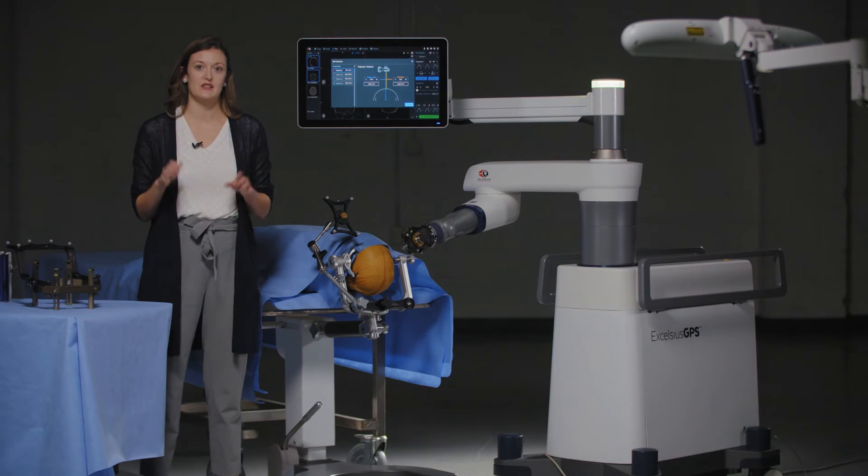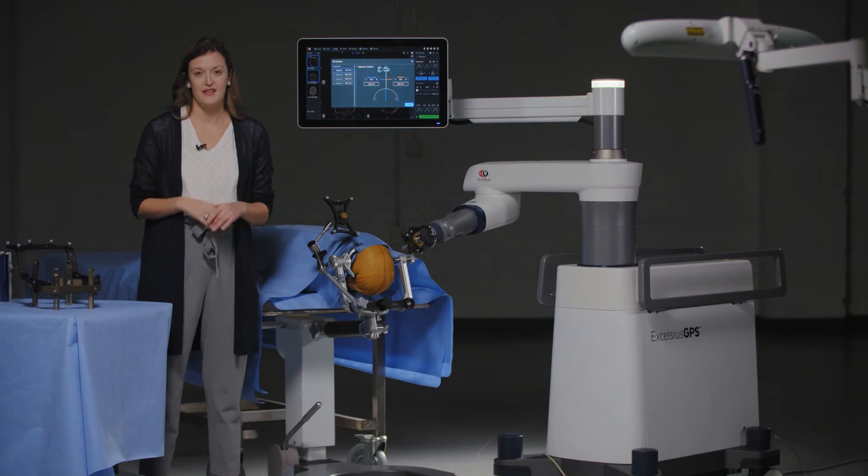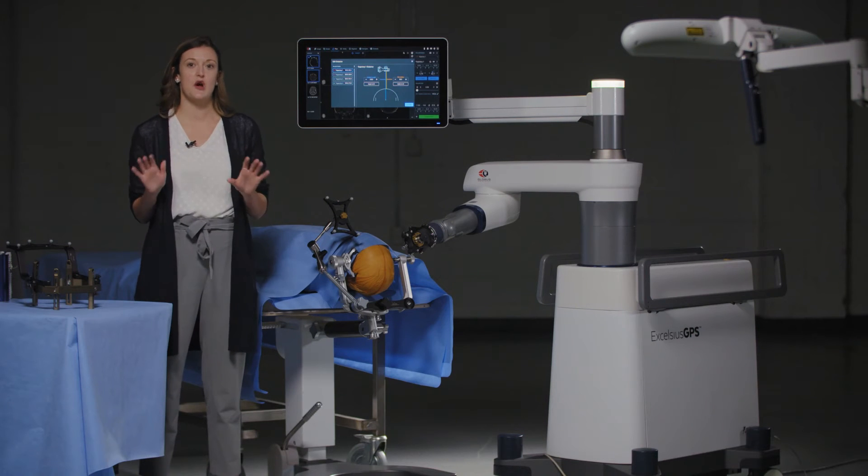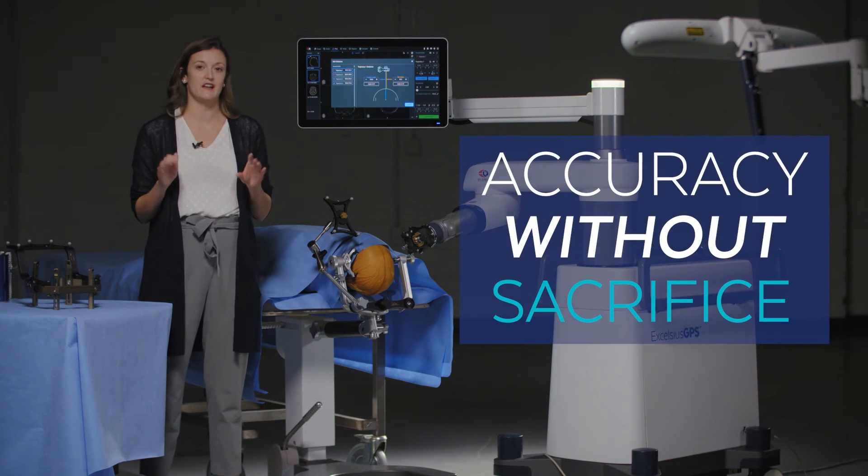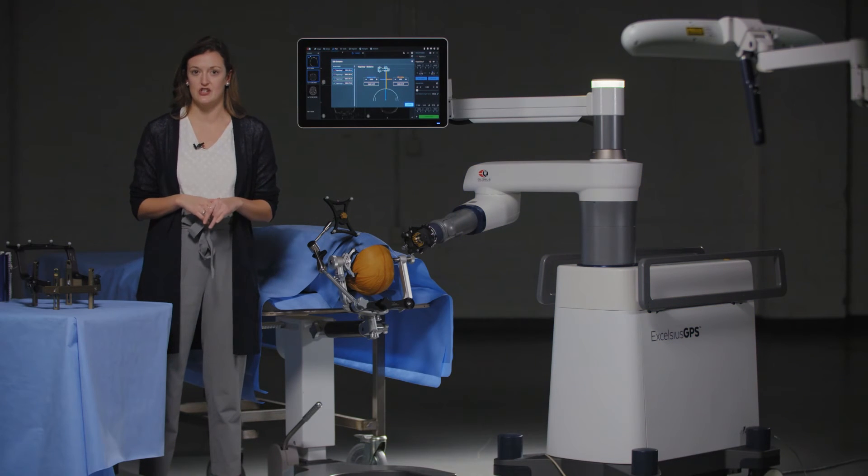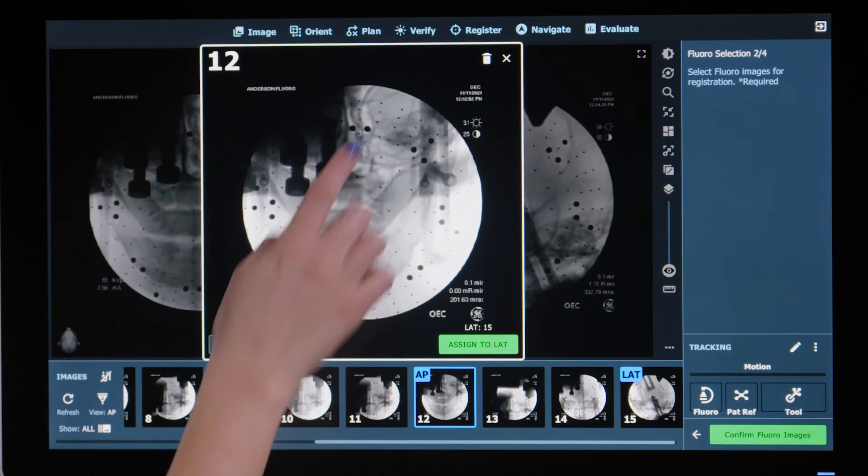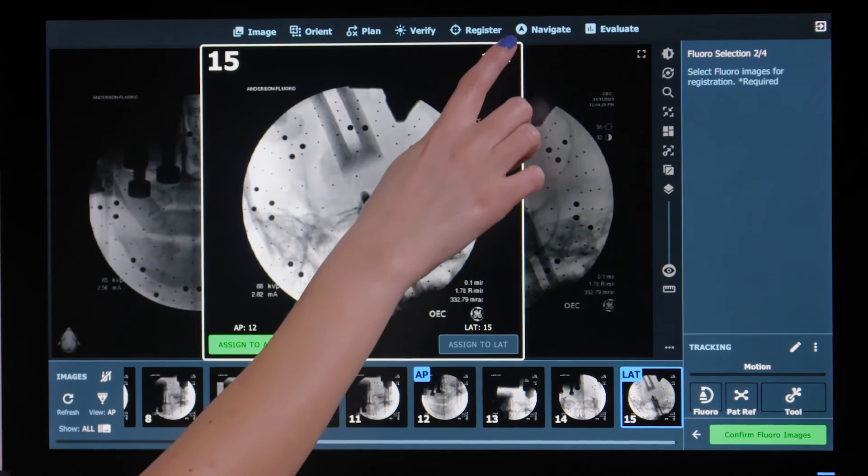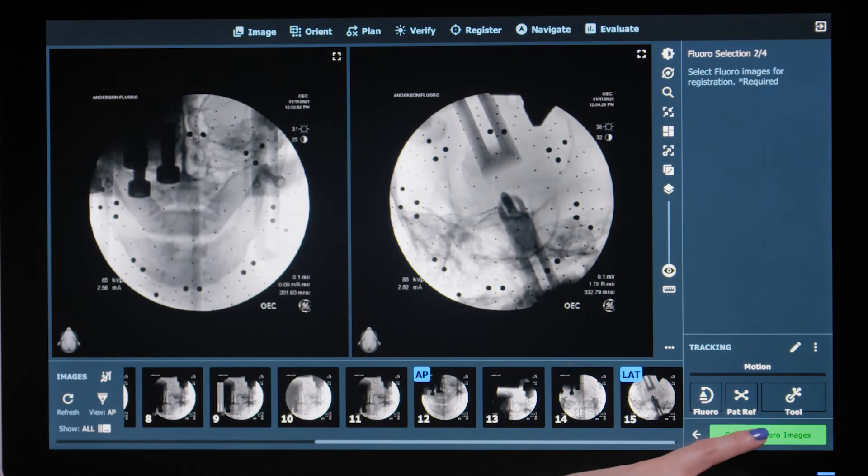Excelsius GPS Cranial Solutions has two registration methods available: intraoperative CT registration and our unique CT fluoroscopy registration. The CT fluoroscopy registration workflow is the first fluoro-based registration workflow for cranial applications on the market. It offers a simplified patient registration option that only requires two fluoroscopy images. It is designed to decrease your registration time while minimizing radiation exposure and maintaining your accuracy.